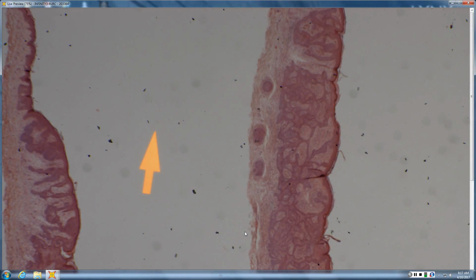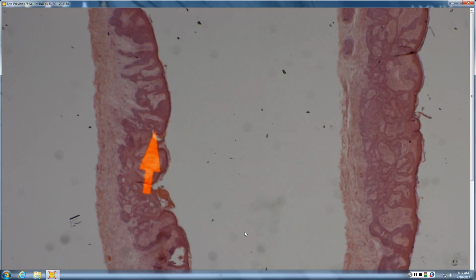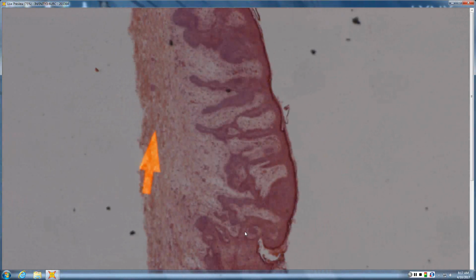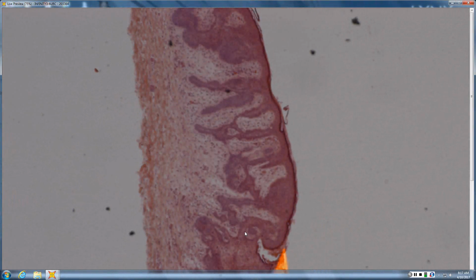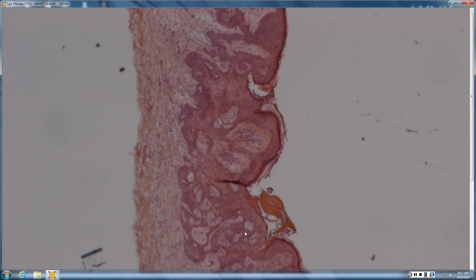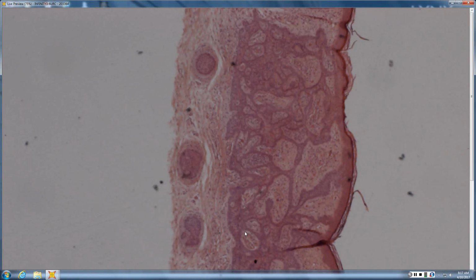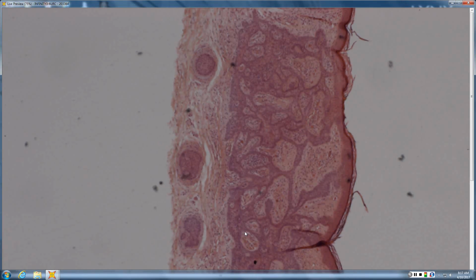Dare I say TFI? You might dare say TFI. The only thing wrong with TFI. Never TFI. Well, that's not true. This kind of area I would love for tumor of the follicular infundibulum. But the basaloid buds here, so what would give you pink strands, blue buds? And they anastomose. And they have eccrine-like ducts in the strands. It's not Pinkus, it's like the other, yeah, Pinkus. So infundibulocystic BCC radiates out from a central follicle, Pinkus anastomosis. So Pinkus tumor.